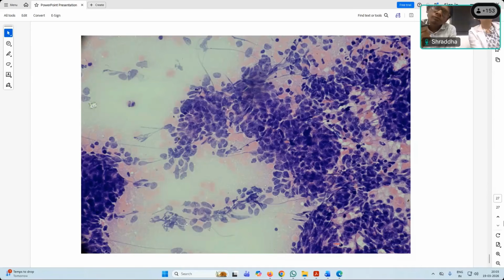Thymoma. What about carcinoids? Carcinoma. Yes, ma'am, carcinoma. Okay, but they don't have this kind of morphology here. So with this morphology, small cell carcinoma should be the diagnosis, and you should work along that entity. So you should write the IHC markers to prove or confirm this.